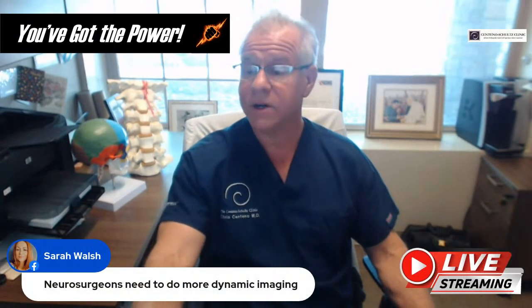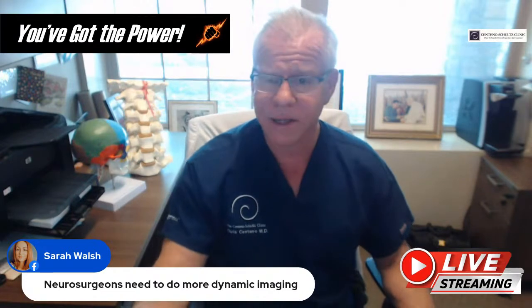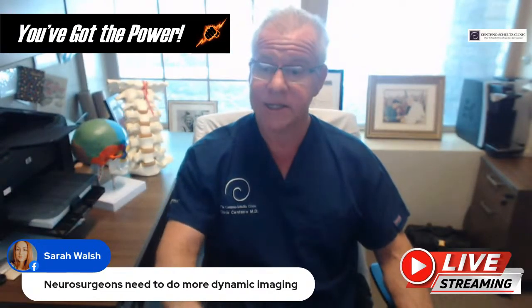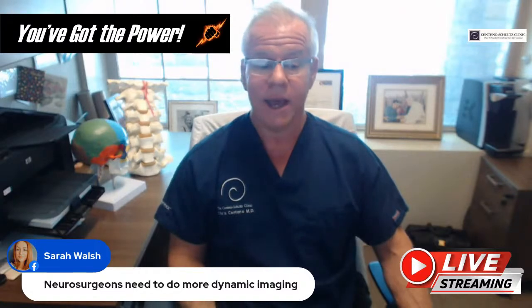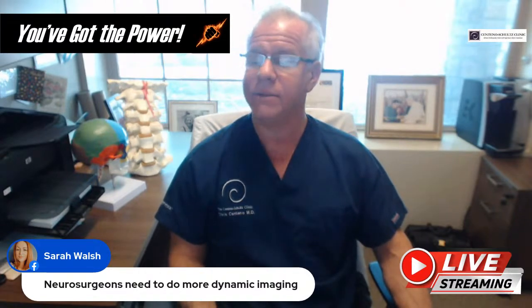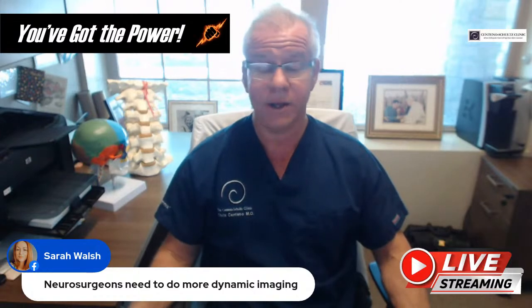Sarah: Neurosurgeons need to do more dynamic imaging. Yeah, I would agree with that, Sarah. I do think that we're starting to see more neurosurgeons who specialize in CCI do more dynamic imaging. I think they're starting to get into flexion extension MRI. I know that Dr. Frank uses a lot of DMX. So we're seeing that. But you're right, the standard neurosurgeon is not using a lot of dynamic imaging, and that can cause some problems.